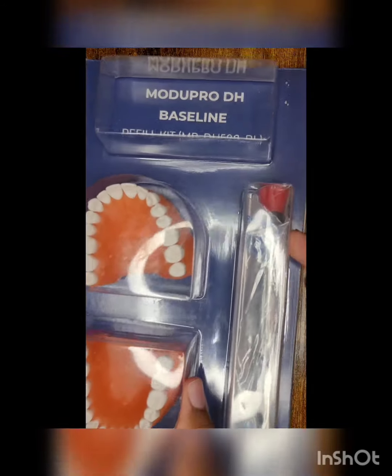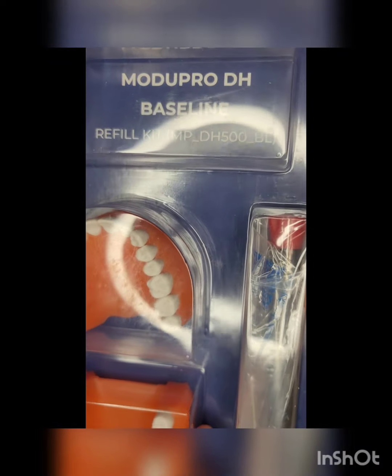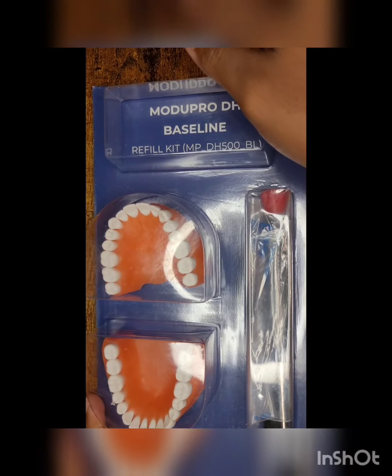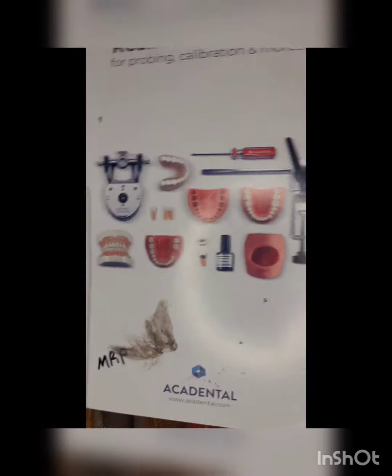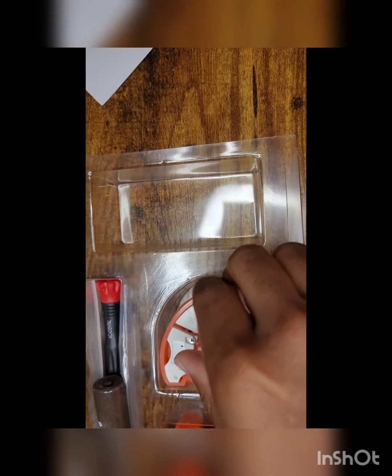Here we have the ModuPro DH Baseline Refill Kit, model number MP_DH500_BL. The reason why this is baseline is because no simulated calculus has been applied to any of the surfaces prior to shipping to you. As you can see, it comes with a maxillary arch and a mandibular arch.